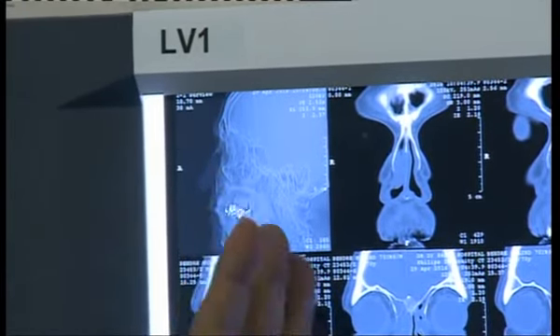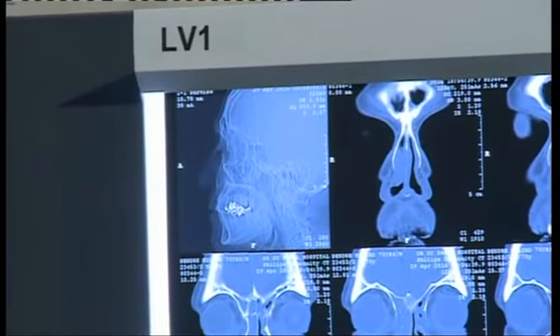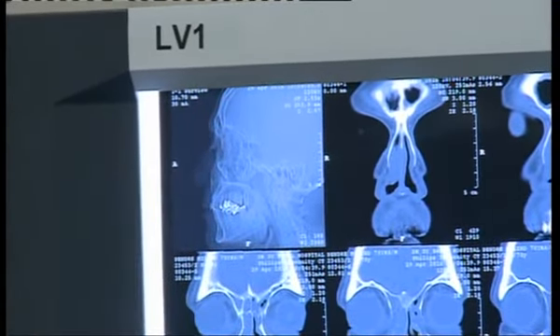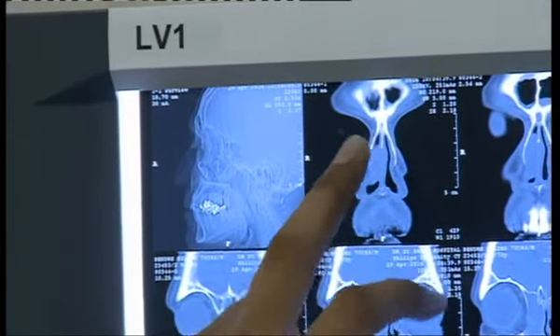So every time we move on behind, we are going to have a jump of 2.5 millimeters. Yes, that is important. So if I go quickly, I think I have 10 minutes because the patient is still being induced.